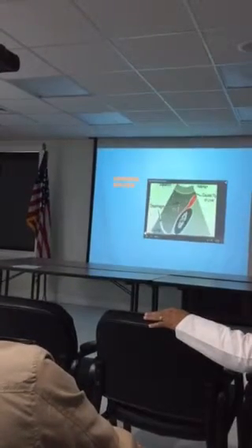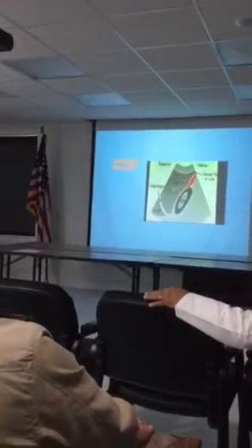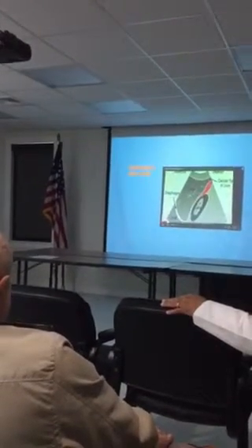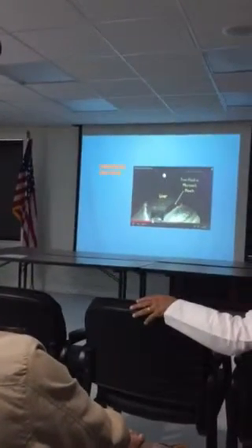Okay, so this is, as I said, the superior part here. This is the diaphragm, this is the lung, this is the kidney, and here the Morrison pouch is going to be here. Okay? So you see the Morrison pouch, the free fluid here. Any fluid is going to be dark, anechoic. Any fluid that is dark is called anechoic.